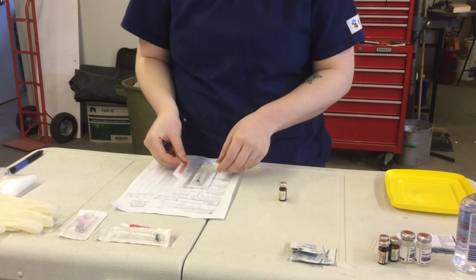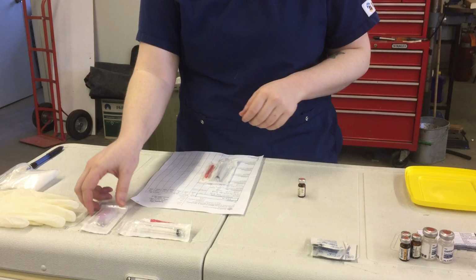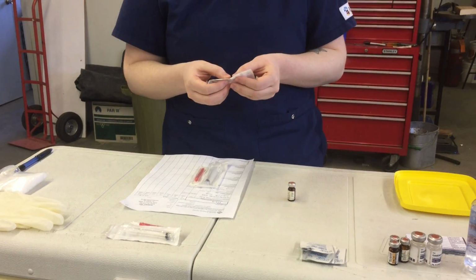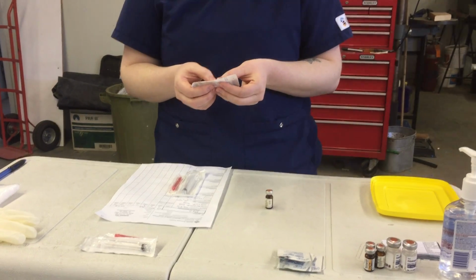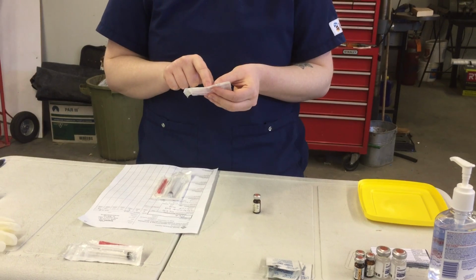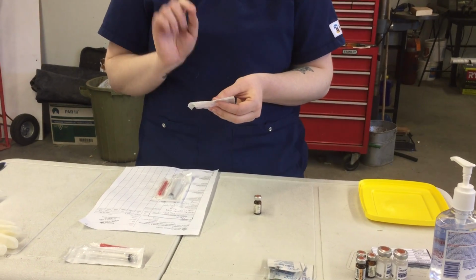I'm going to need a blunt fill needle to draw up from my vial, and I'm going to get my correct injection needle here. So for a subcutaneous injection, we're going to need 25 to 31 gauge. This is 27 gauge, so that's correct. And we're going to need length of 1/2 inch to 5/8 of an inch. This is 1/2 inch, so that is correct.